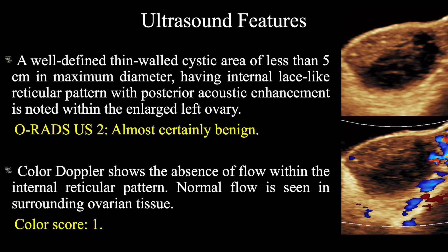So in summary, a well-defined thin-walled cystic area of less than five centimeters in maximum diameter having internal lace-like reticular pattern with posterior acoustic enhancement is noted within the enlarged left ovary. Color Doppler shows absence of flow within the internal reticular pattern, and normal flow is seen in surrounding ovarian tissue. These features concluded as a case of left ovarian hemorrhagic cyst, given an O-RADS ultrasound score of 2 with a color score of 1, indicating an almost certainly benign condition.